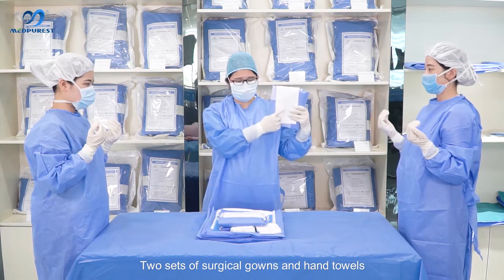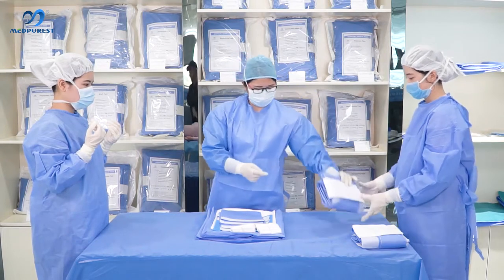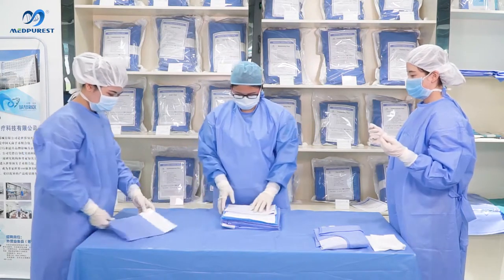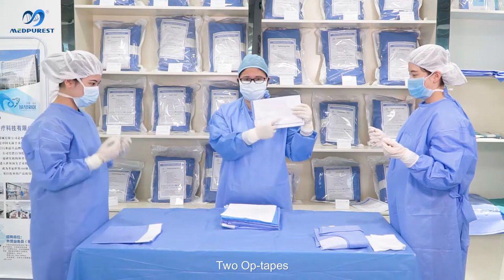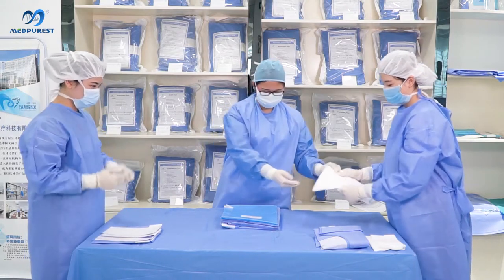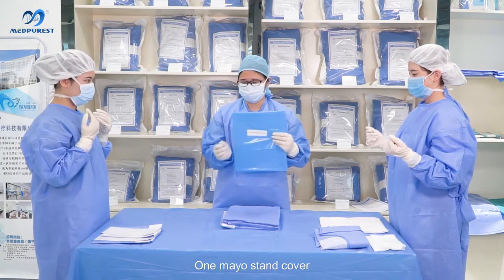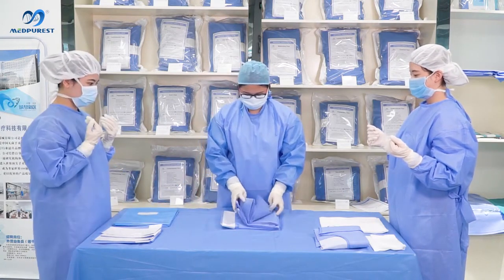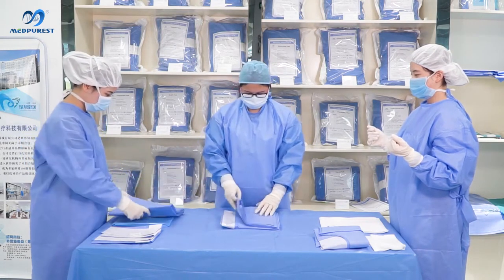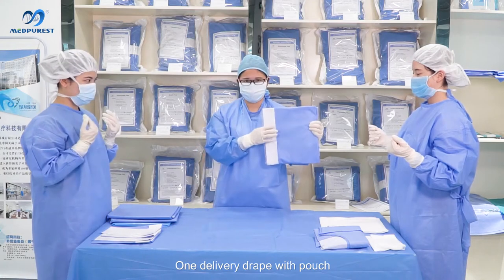The components include: two sets of surgical gowns and hand towels, one side strap, two OP tapes, one baby drape, one clip, one Mayo stand cover, two leggings, and one delivery drape with pouch.